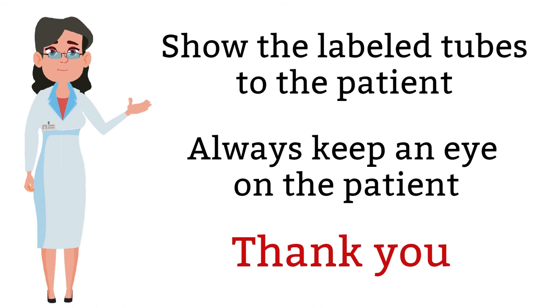Seventeen. You then thank the patient for his or her cooperation and exit or let the patient go.